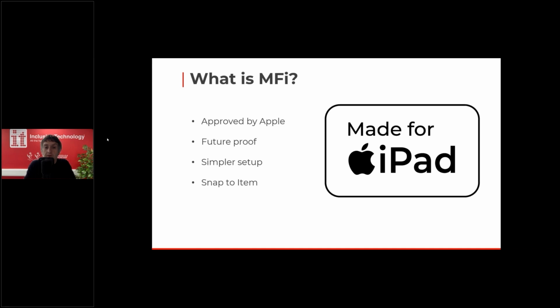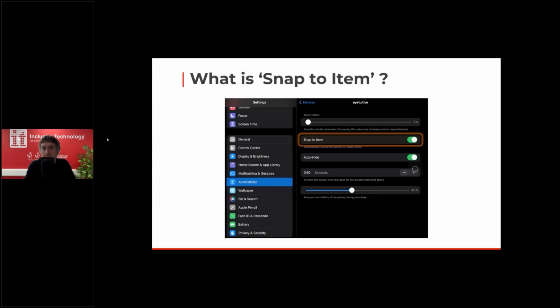The other thing on there as well is Snap to Item. And Snap to Item is a form of control you might not be aware of, but we've got a slide that will show you exactly what it's about.